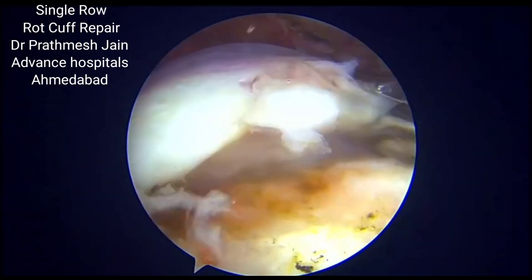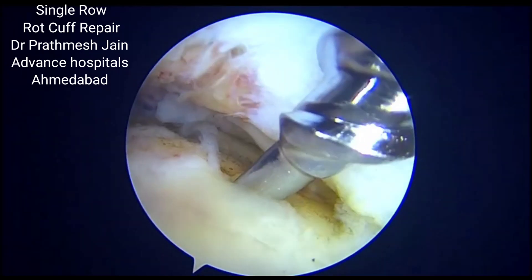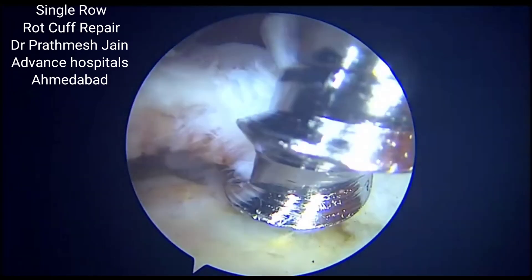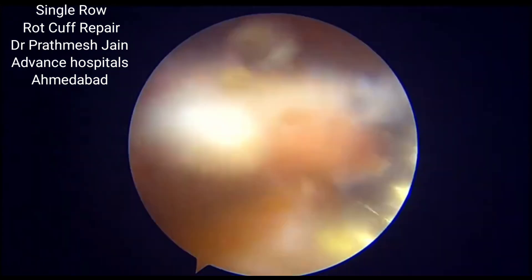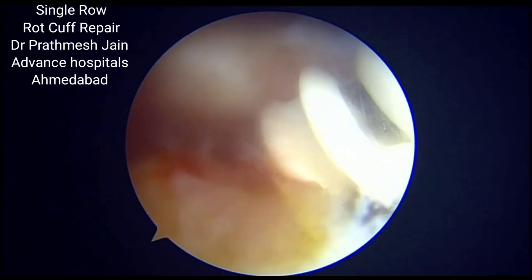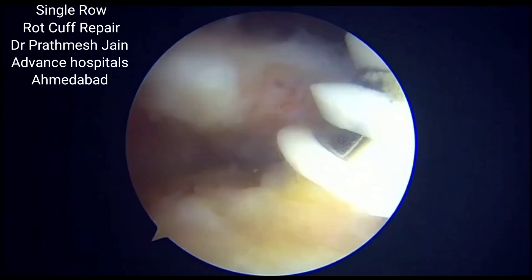Full thickness medium size crescent tear involving both upper and lower lamina. It is around 2.5 cm in size and the most easy way to repair this cuff is a single row rotator cuff repair.